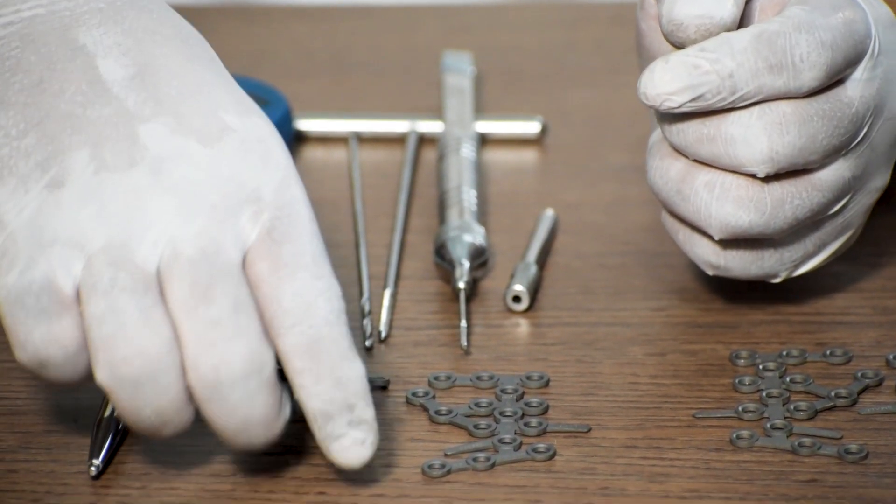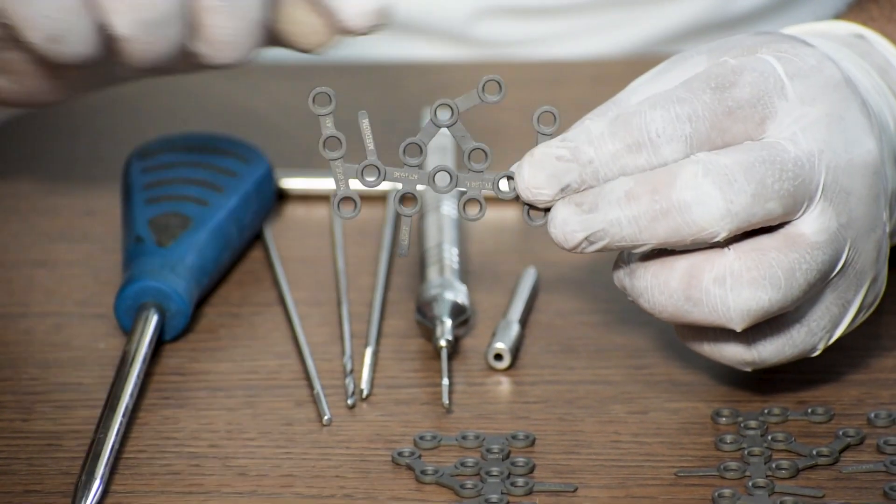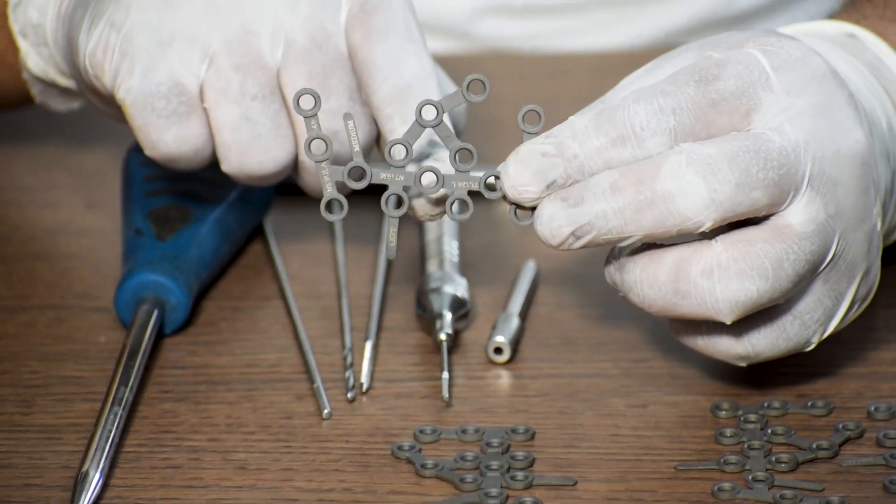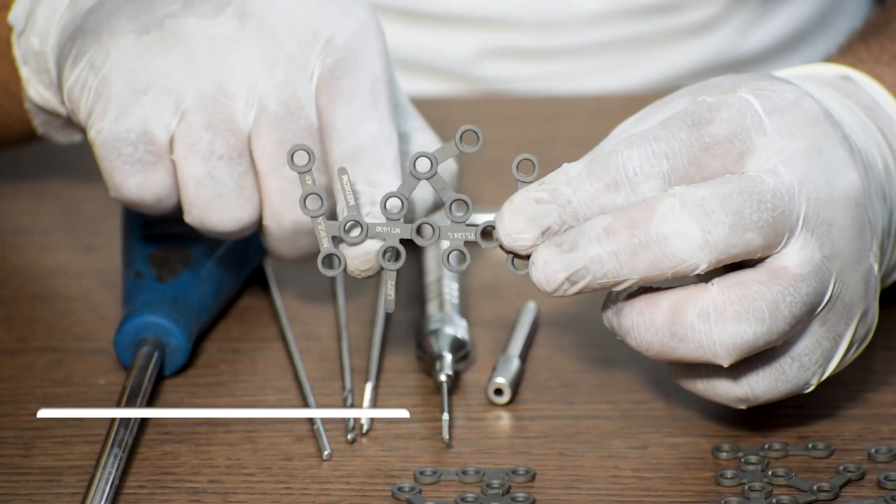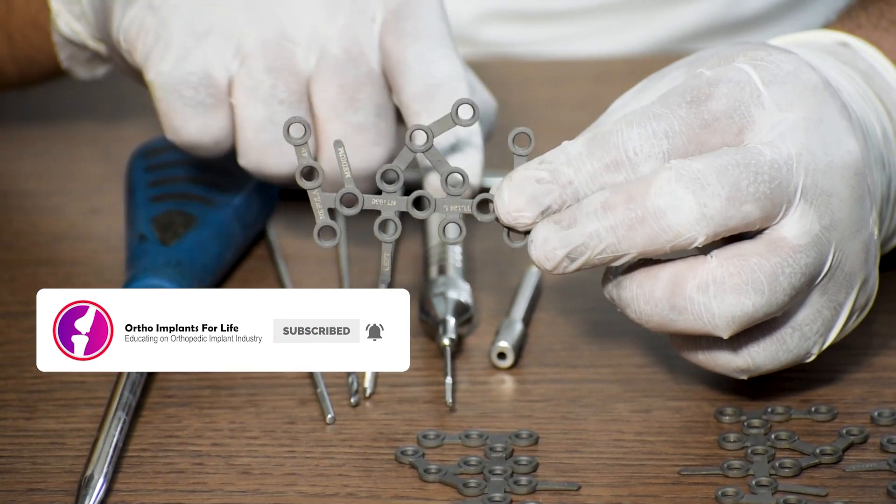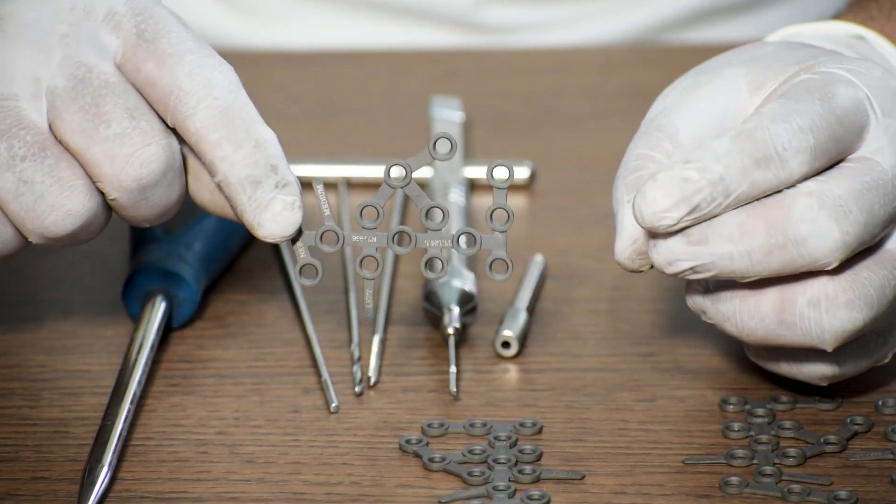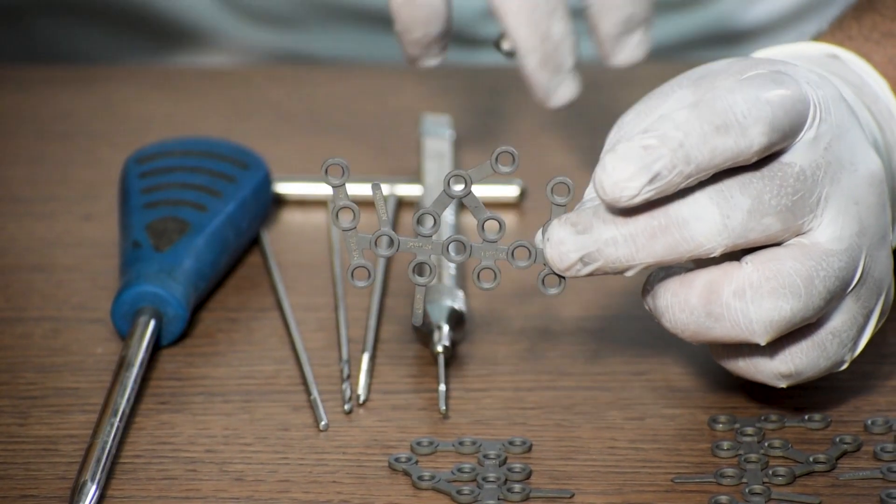Now let's come to the fixation part. As you can see these holes, these are all locking holes. You can pass a locking screw, either a locking screw or a non-locking cortical or cancellous screws can be used to attach this plate in the fracture site.